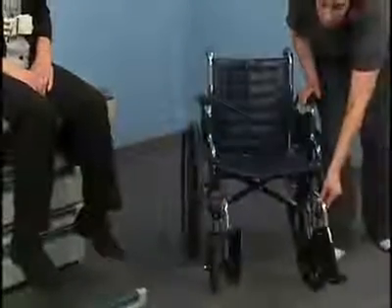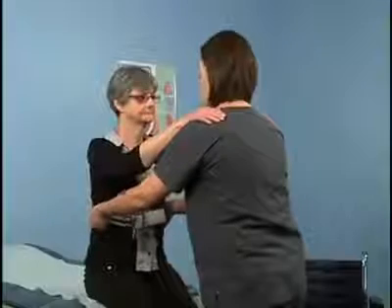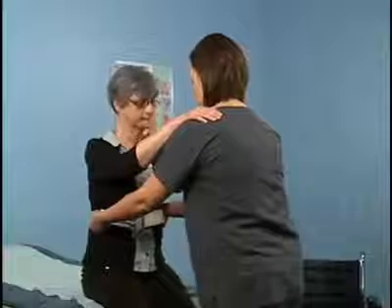Inform the patient about what to do during the transfer. Ask the patient to place her arms on your shoulders, but not around your neck, as this could cause an injury. Stand in front of the patient with your feet apart, one slightly in front of the other and knees bent. Grasp the transfer belt on either side of the patient's waist using an underhand grasp and instruct the patient to stand on the count of 3, using the muscles in her legs and thighs.